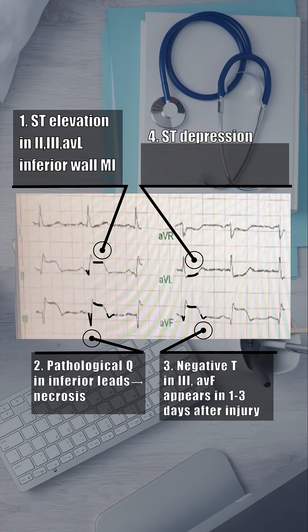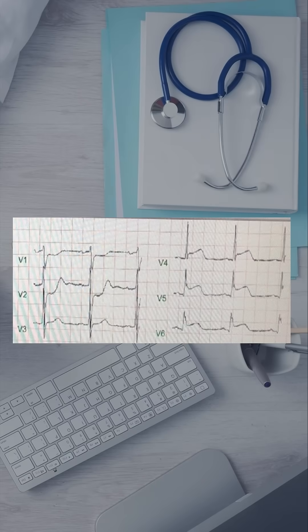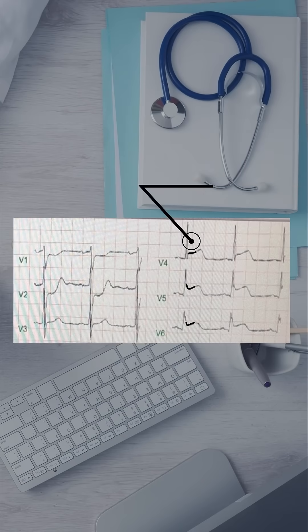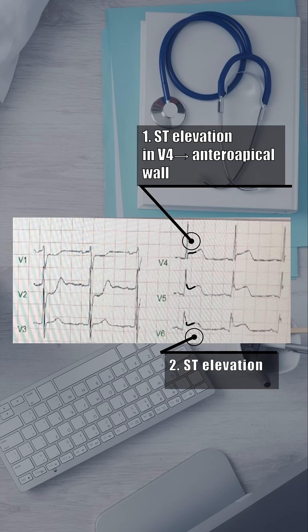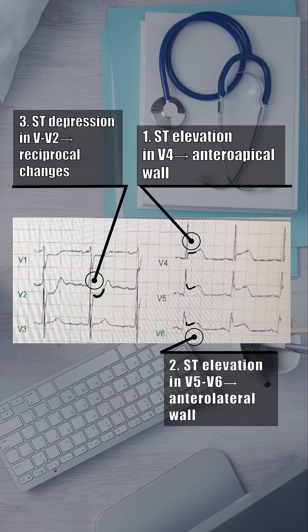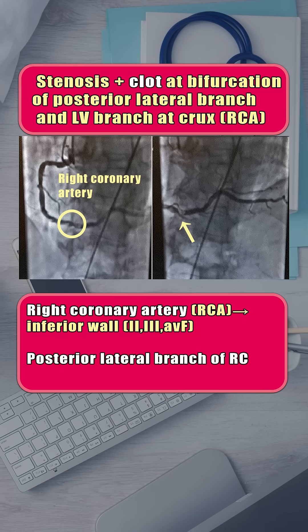Lead aVL shows ST depression — the reciprocal change. In the chest leads, ST elevation from V4 to V6 suggests anteroapical and anterolateral wall involvement, with reciprocal ST depression in V1 and V2. Angiography confirmed a right coronary artery clot at the bifurcation of the posterior lateral and left ventricular branches at the crux, explaining both the inferior wall changes and the changes in V4–V6.